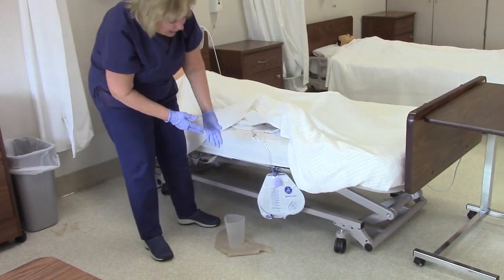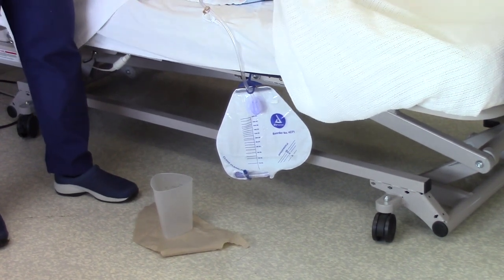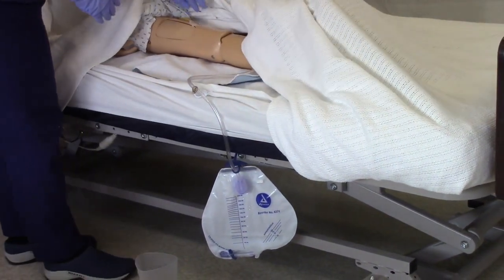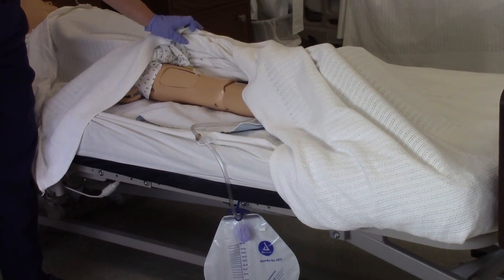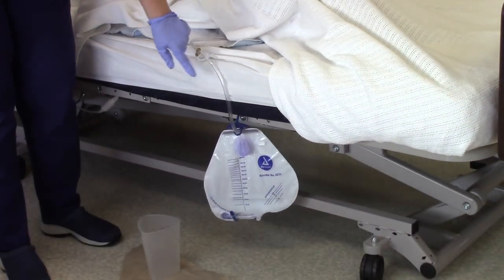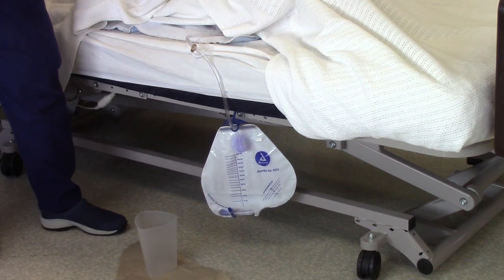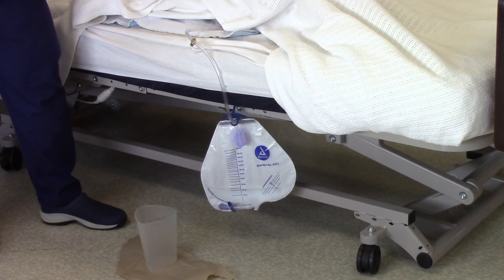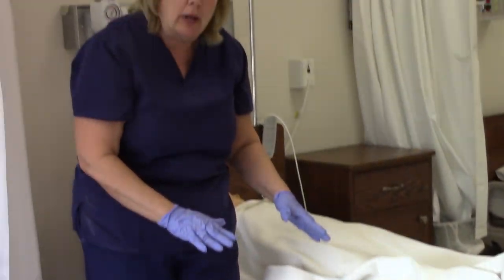Here is the patient's Foley catheter bag. Besides emptying it, as a nurse's aide or nursing student, you also want to check the tubing to make sure it is not kinked or coiled. You also want to make sure it is taped on the thigh, because if it pulls, it pulls on the thigh and not on the patient's urethra. Another part to assess is the last 8 to 10 inches — you have it clipped on the bed and perpendicular, which allows for proper drainage of the patient's urine by gravity. Under no circumstances should that bag ever be raised higher than the patient's bladder, because urine will flow back and cause issues for the patient.